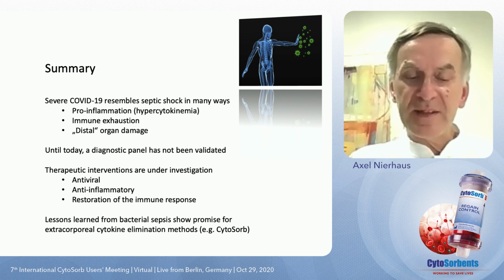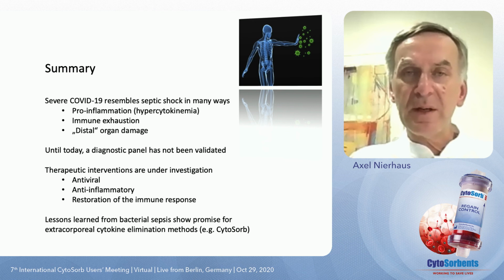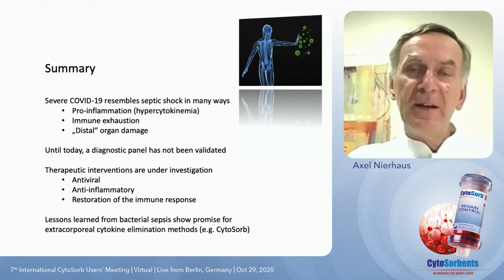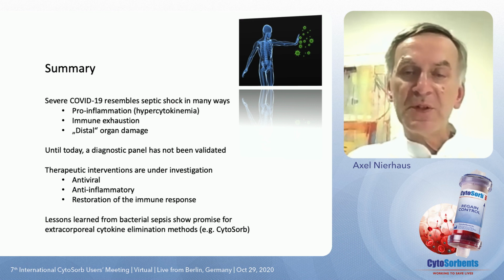Now we have lessons learned from bacterial sepsis, and I think they show promise for extracorporeal cytokine elimination means, for example CytoSorbents and CytoSorb, and we will see if we can reduce the inflammatory load and by this alleviate distal organ damage in the future.